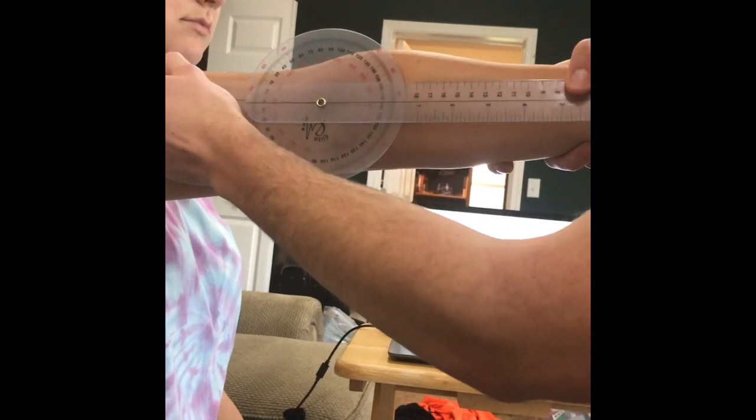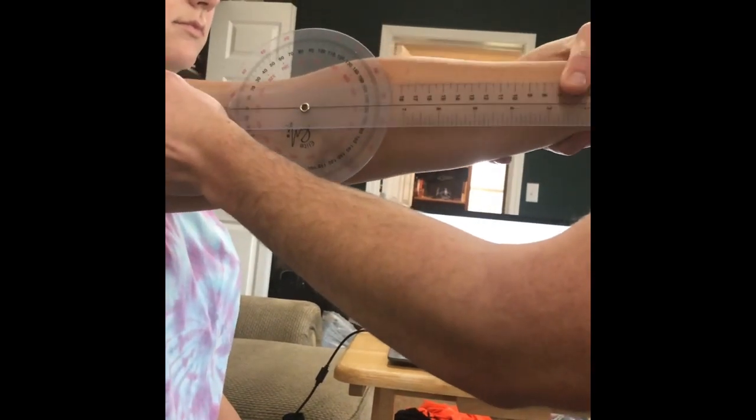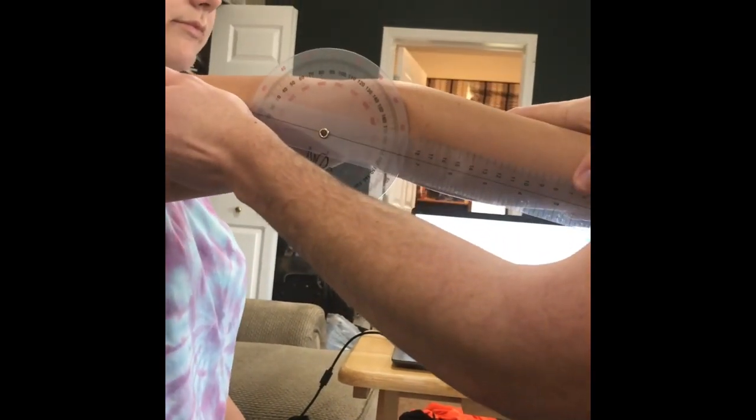And then you're going to have your axis of the patient go into hyperextension, like so. And moving off, it's about 9 degrees of hyperextension.